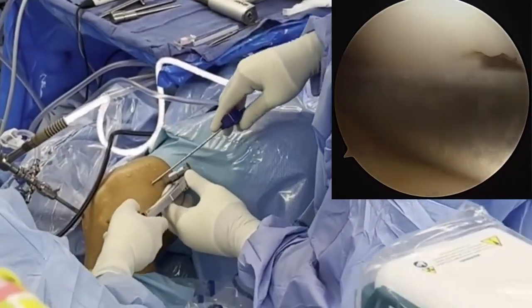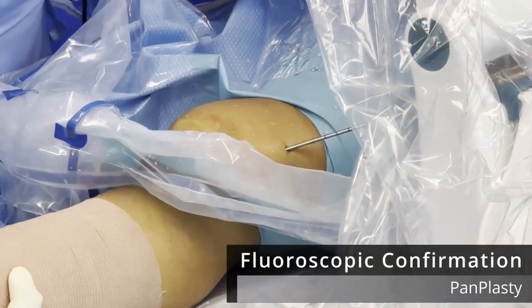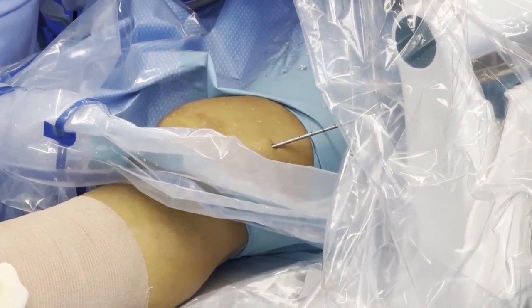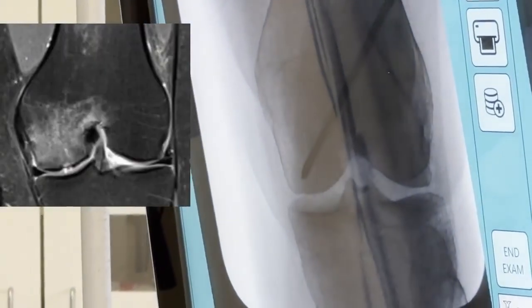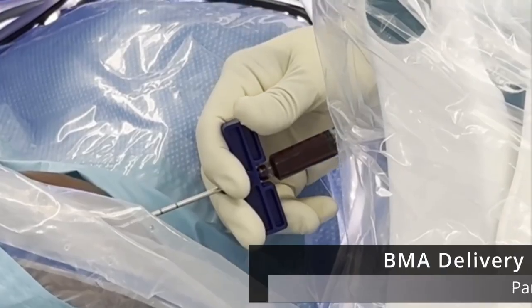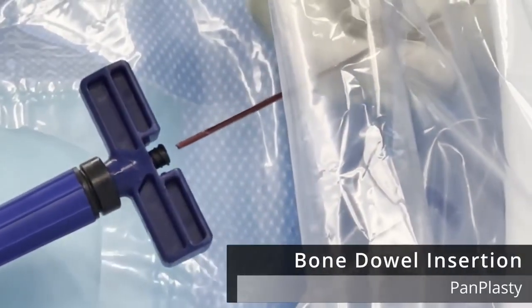At this point, fluoroscopy is used for confirmation rather than targeting, thereby minimizing cumbersome positioning and radiation exposure. Fine-tuning may now be performed as well. Once the desired position is confirmed, selected materials are administered through the Luer lock mechanism, utilizing either the end delivery or side delivery cannula. Bone grafting may also be placed through the end delivery cannula.